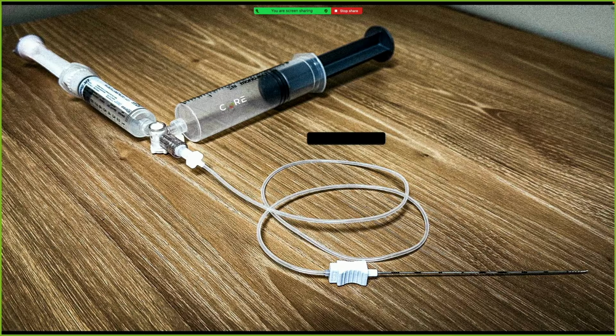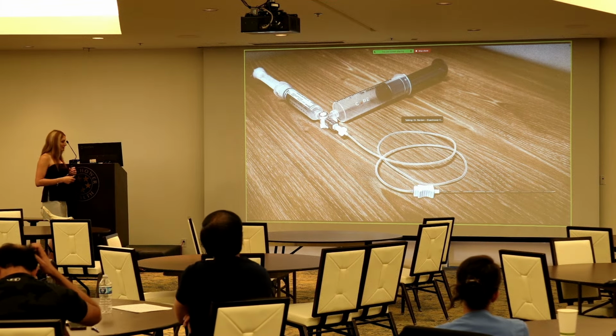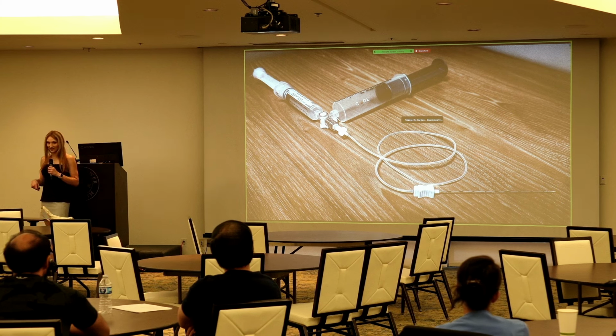You can do this thing, which I have a hard time with. Do you do this, Matt? When you talk to nerve block experts, like the people who taught me, what they recommend is the anesthetic here, and then just normal saline to hydrodissect as you go in with the needle, and then switch over to the lidocaine when you know you're in the right spot.